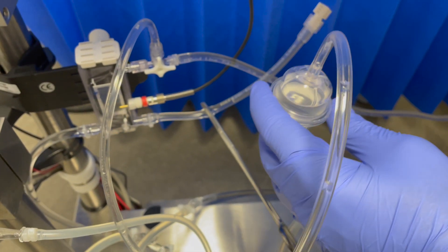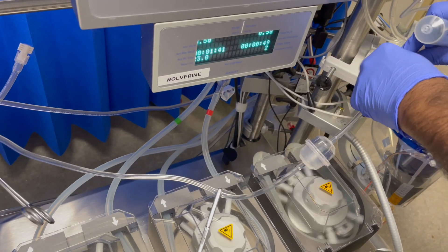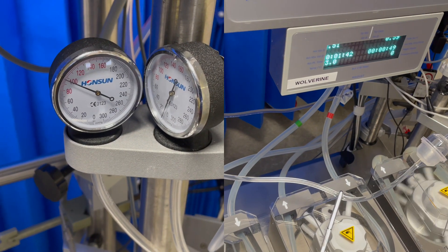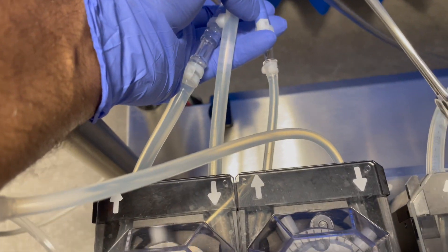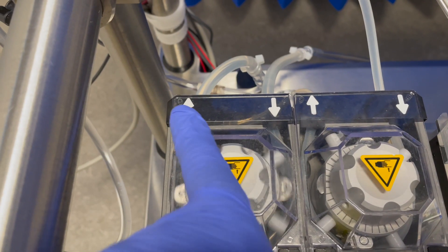Start de-airing the pressure isolator. Once de-aired, connect it to the pressure monitoring system. To make sure the pump tubing is in the right direction, physically feel the tube and check the in and out directions.